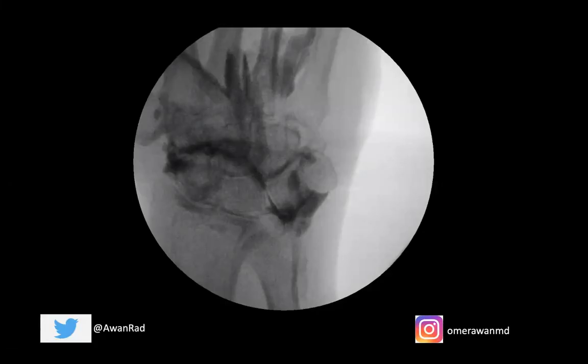Hello everyone and welcome to week 10 of MSK case series. This is a great case that I would love to show. Here we're seeing a fluoroscopic injection — we've brought the patient under x-ray guidance and we're injecting contrast into the wrist joint, the radiocarpal joint.